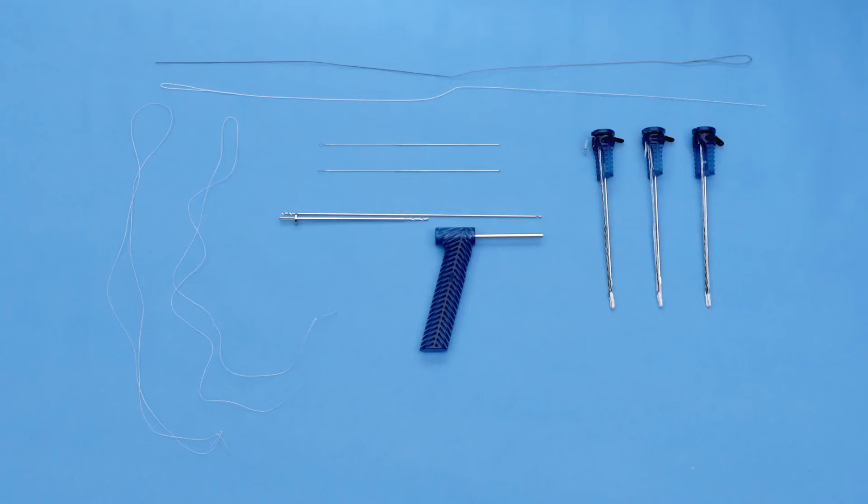Hi, I'm Zach Stinson from Orlando, Florida, and today I'm going to be demonstrating a medial patella femoral ligament reconstruction technique using an onlay technique with Arthrex double knotless knee fiber tacks.